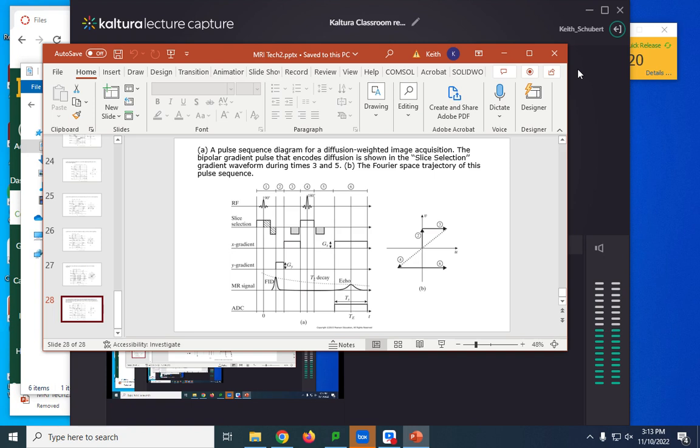You can do correction, and we'll see, the further on we go, people will come up with better and better methods to estimate them. If you have a 4D CT scan available to you, then you can correct the motion using a fluid mapping. That is one of the research areas I'm working on: how to do these kinds of samplings to put it back from 4D into a 3D.